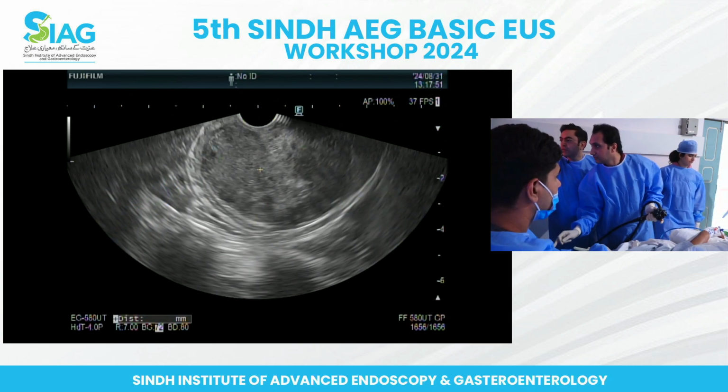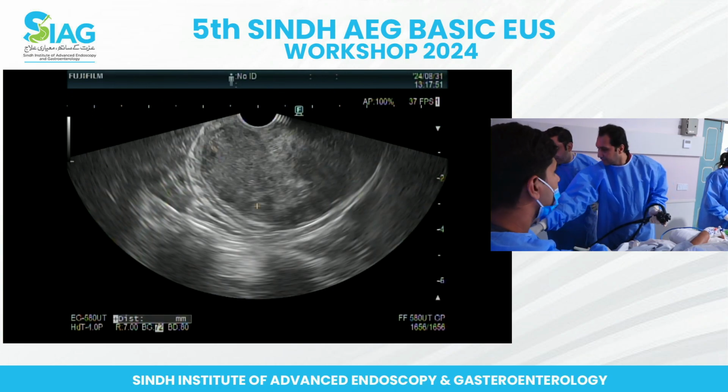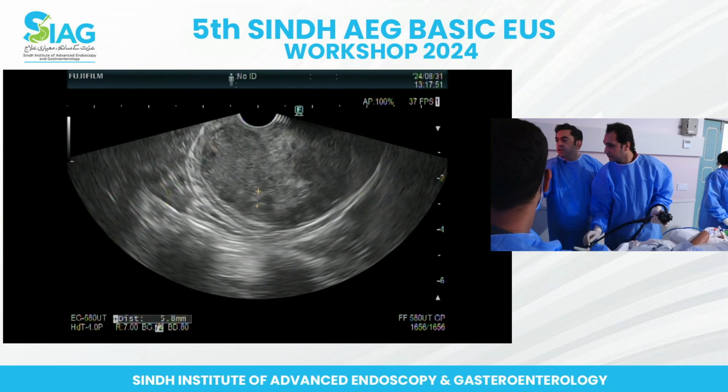अरे एक मिनट देखो, ये कैसे खत्म हो जाता है? ये तो नहीं है. नहीं, नहीं. ये तो मेन्यू पे चला नहीं जाएगा. नहीं, ये तो यार ये बैक है. अच्छा नहीं, ये फ़र्क है इसका, उल्टा हुआ हुआ है. ये बैक और एंटर भी उल्टा हुआ हुआ है. ठीक है, तो ये तो खैर मैंने गलत कर लिया.